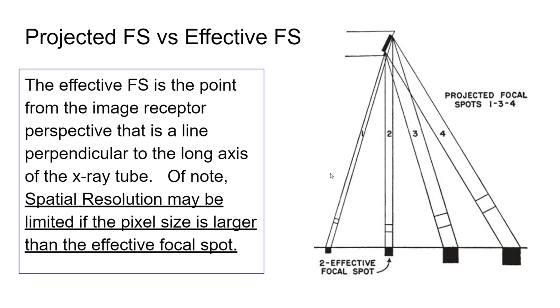And anodes are made like that? They're made at all different types of angles? Yeah, they have different angles. On average, though, for diagnostic radiography, for different types of special procedures, the angles change. They might be different in mammography. They can be different in the dental world.